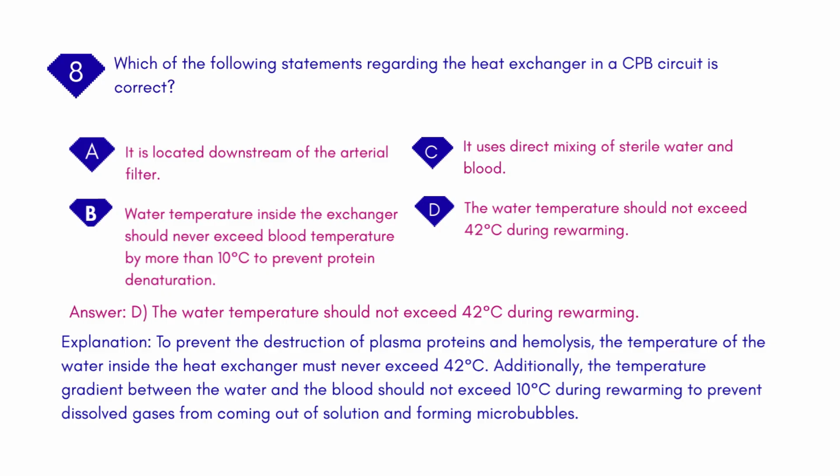Additionally, the temperature gradient between the water and the blood should not exceed 10 degrees Celsius during rewarming to prevent dissolved gases from coming out of solution and forming microbubbles.